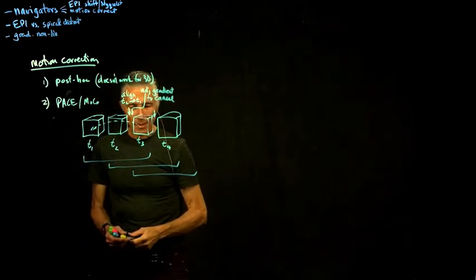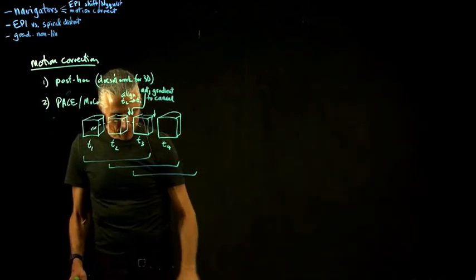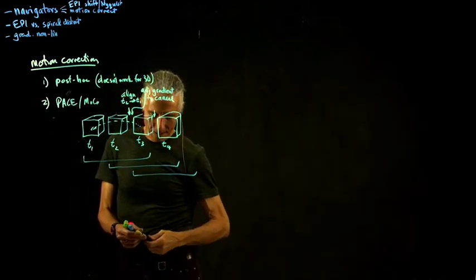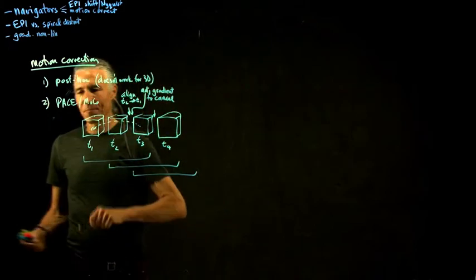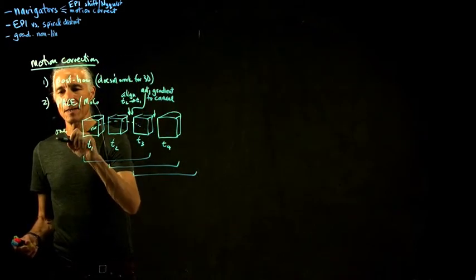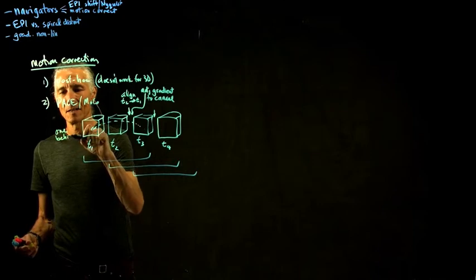So that generally works reasonably well, especially if you don't move a lot. But you can see it's always one behind. One behind. And it doesn't work for 3D.